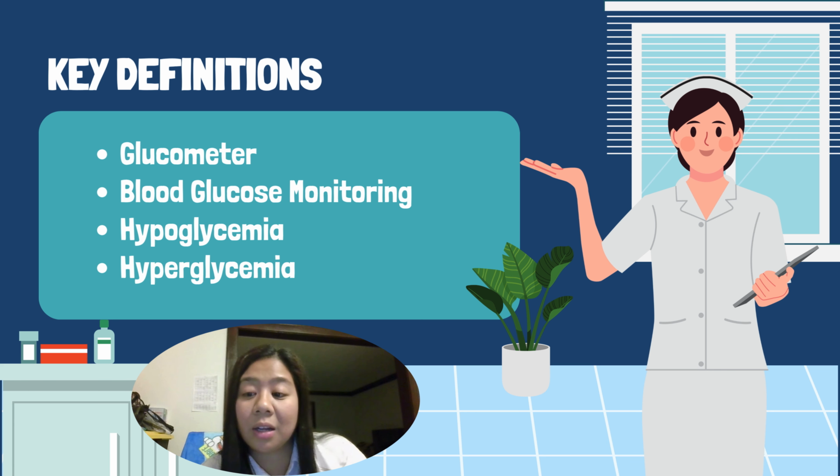According to the American Diabetes Association, or ADA, the normal blood glucose level, particularly for most people with diabetes taking medication, should be between 80 to 130 milligrams per deciliter before meals. However, for 2 hours after the start of a meal, a healthy blood glucose level is less than 180 milligrams per deciliter. That's according to the CDC. These are general guidelines, and individual target ranges may vary depending on age, health status, and other factors.